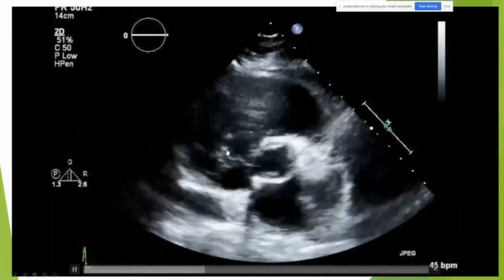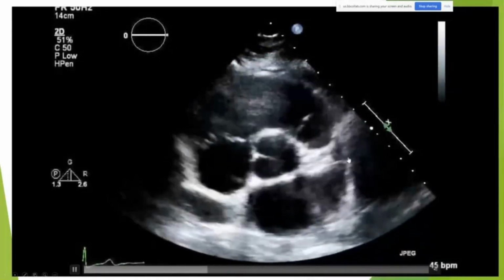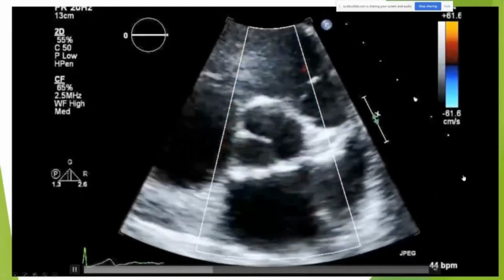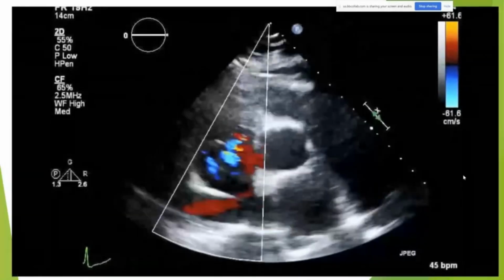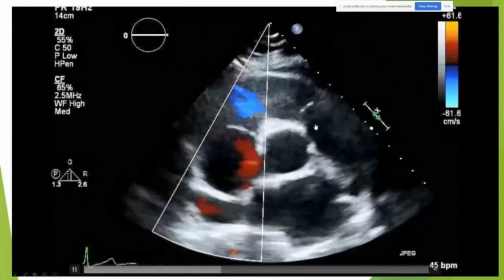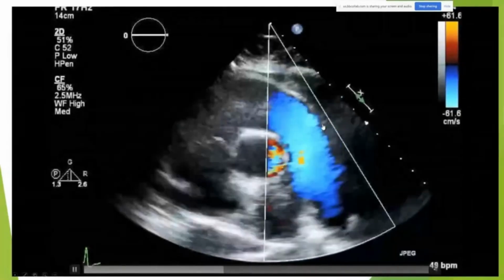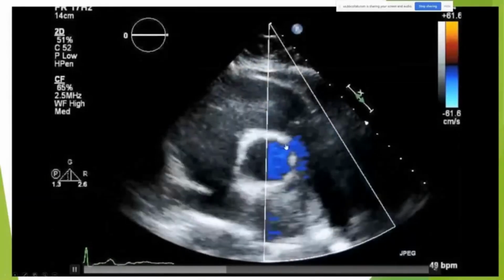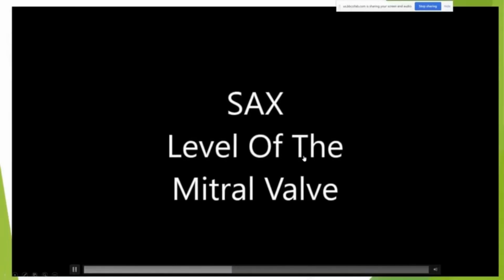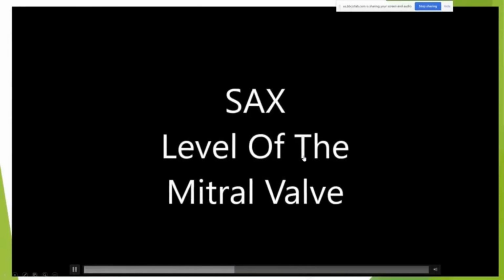We've been talking about this view all day. Look at that left atrial appendage right there. They have some TR, mild to moderate, and I want to say they had pulmonic insufficiency, but maybe it was because of right there. And you don't just want to see that and say there's a shunt, because there may not be.